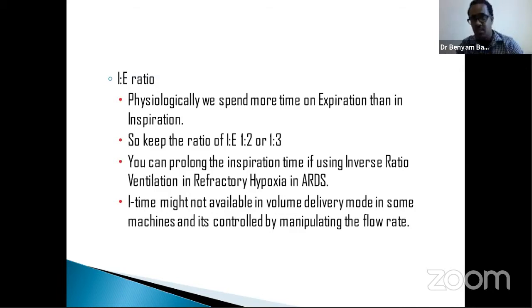You can manipulate that. If you are using volume control modes, usually they don't have inspiratory time to be set, so usually play with the flow rate. By manipulating the flow rate, you will adjust the inspiratory time, so indirectly you will adjust the IE ratio. So always keep that in mind. But some machines may have inspiratory time to be set on volume mode, so you can set that. If not, use the flow rate. Most machines usually rely on the flow rate when you are using the volume mode.